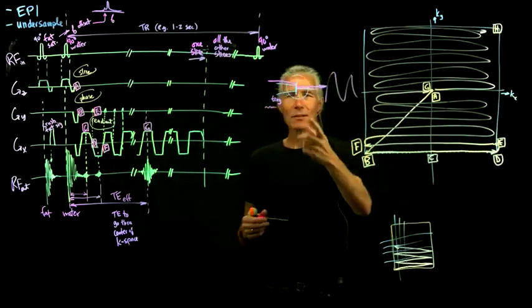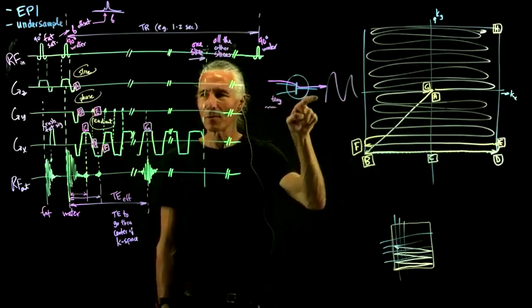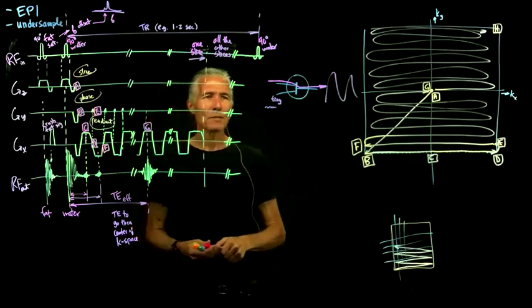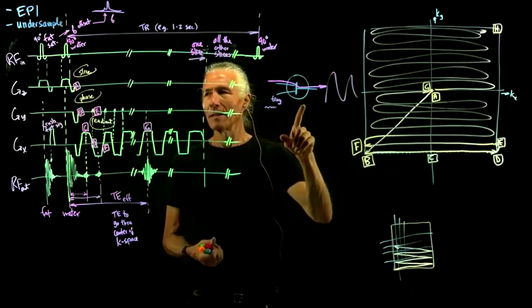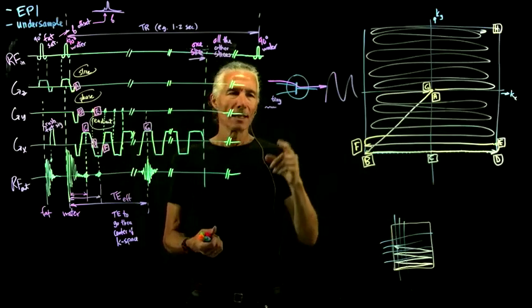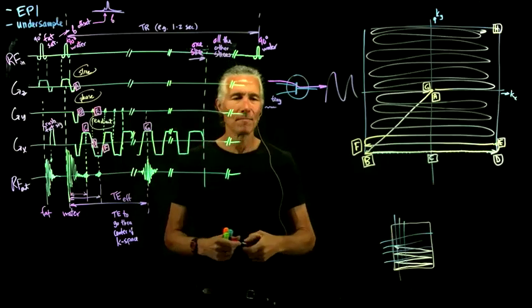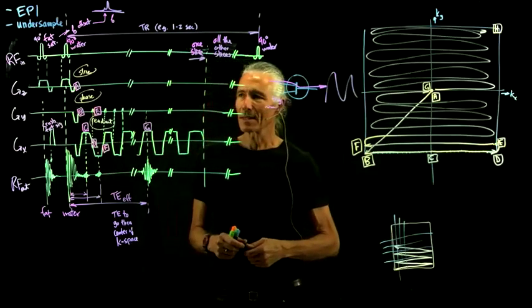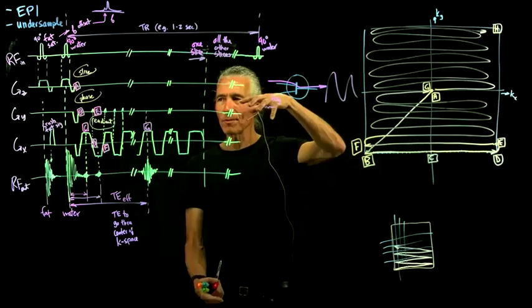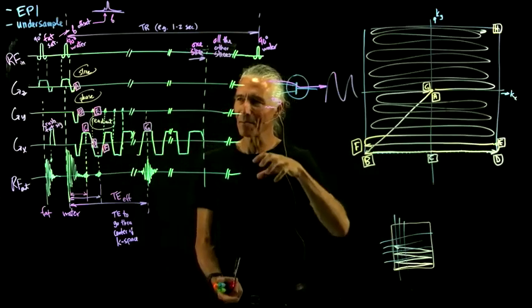And if you use a transistor like that, there's limits on how much power you can run through the transistor. So it turns out there's another way to make the transistor work, which is just to make it work as a switch, just an off-on switch. If you do that, it's possible to run a lot more current through the transistor. And that's the way the amplifiers that we have now work. And that's why you can get a 1,000,000-watt amplifier into a little container this big. It's water-cooled because it gets quite hot.